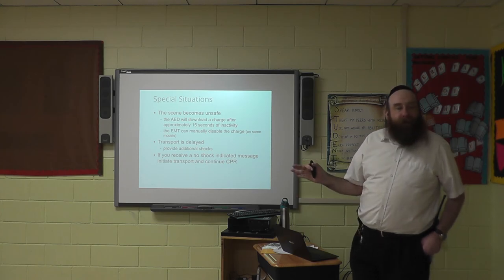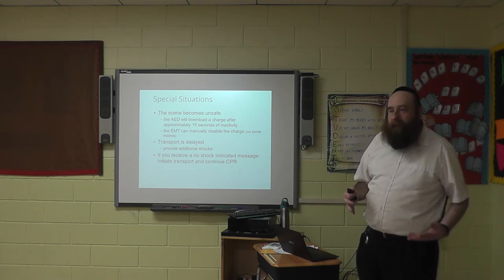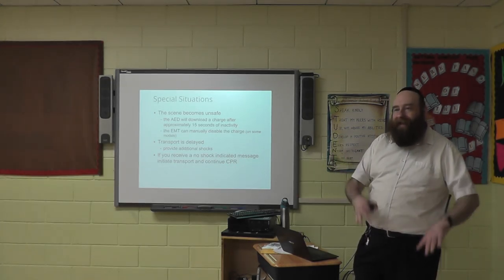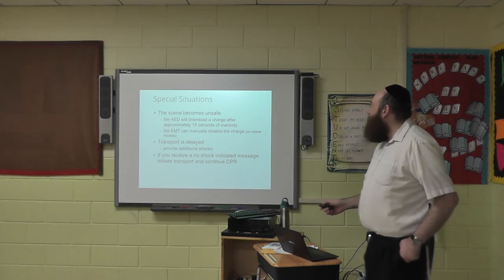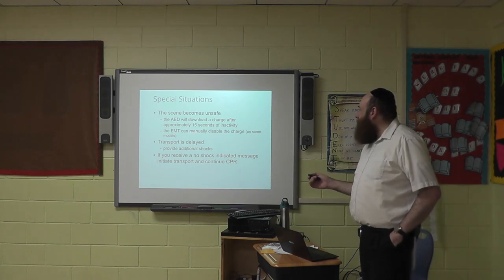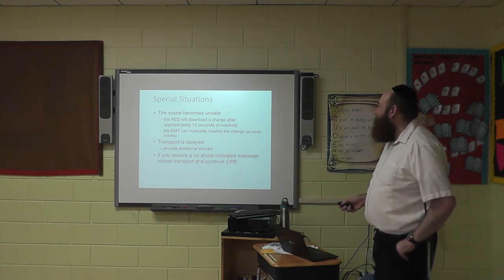You need to shut it off. You need to shut the defibrillator because remember those pads are live, ready to shock. So shut it off. If you shut it off, it will discharge the charge that it has, and after 15 seconds of inactivity it will also automatically discharge.